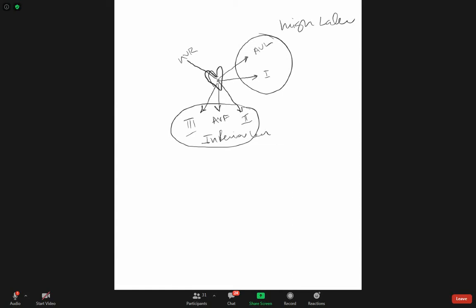Now let's go back again to the heart here. Let's imagine this is the chest wall. So here you have V1 and V2, they look at the septum. Sorry, V2 is here. Then you have V3 and V4, they look at the anterior wall. Then you have V5 and V6, they call them laterals. So these are also lateral. They look at the heart from the lateral side. And these four we call anterior. Do we understand now how they look?